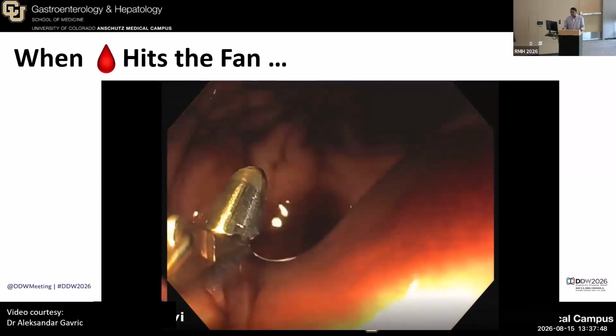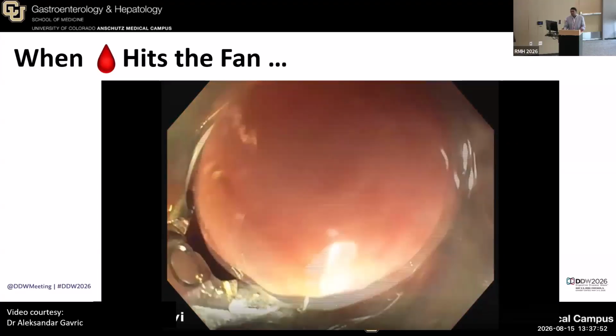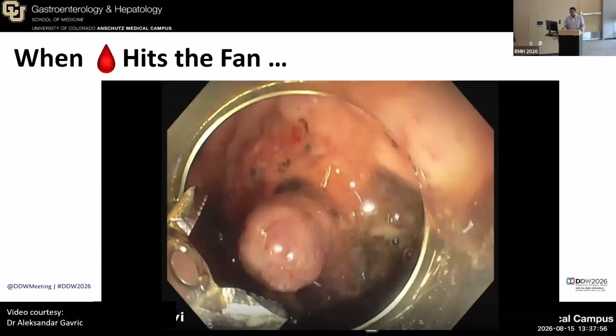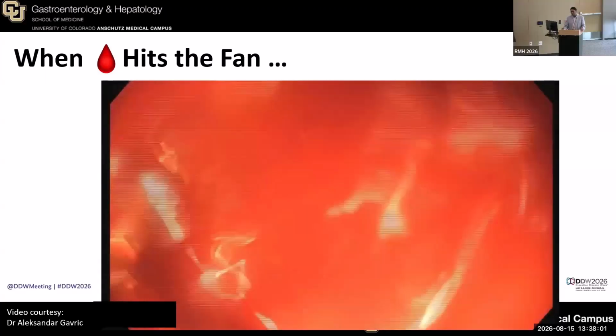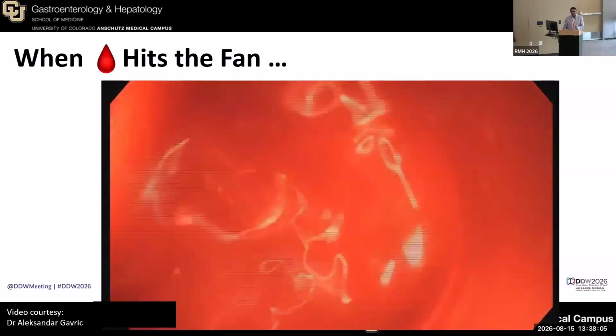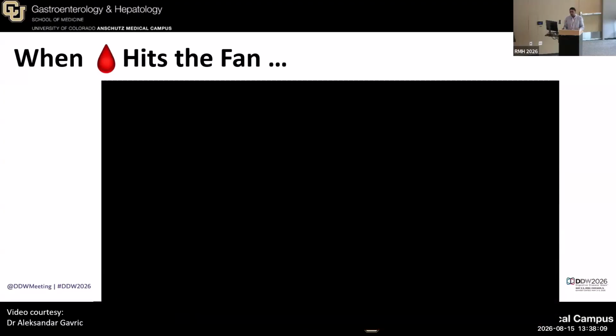So this right here is a big vessel, right? So you've seen this talk and you're ready to tackle every single bleeder that comes your way. So you see this vessel. This is one of my colleagues from Europe who kindly shared this video with me. When you see this vessel, you grab it with a coag grasper, you've listened to me talk, and then this starts happening. So rule of thumb, if your vessel is bigger than your device, it's not going to work. So in this case, they shouldn't have used a coagulation grasper or forceps. The patient ended up needing emergent IR embolization.